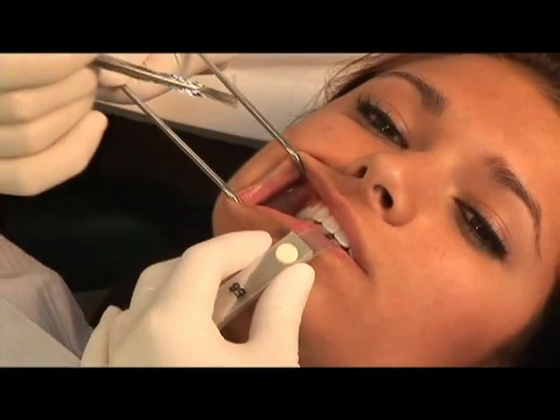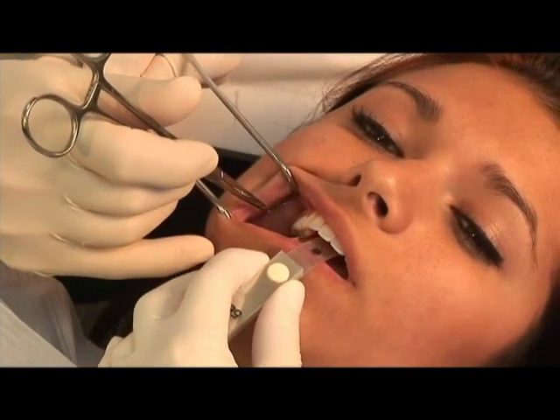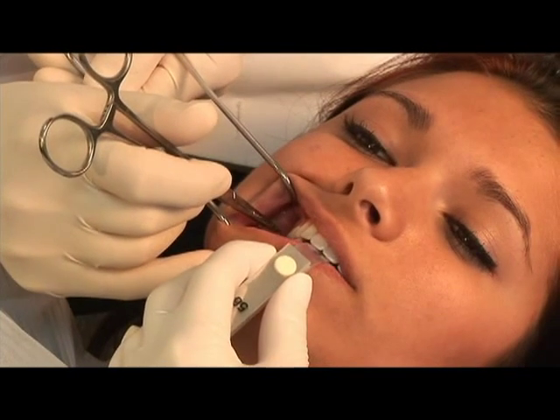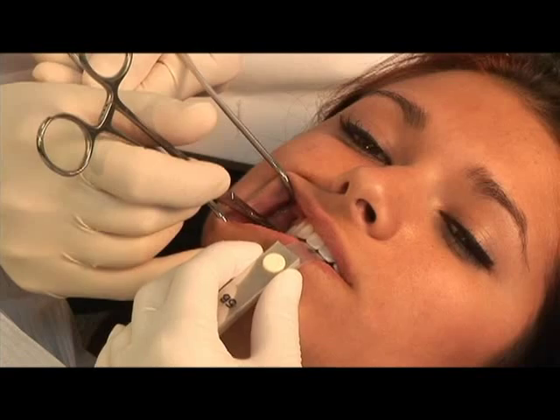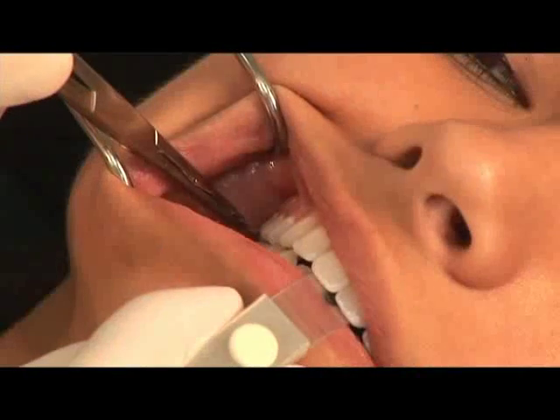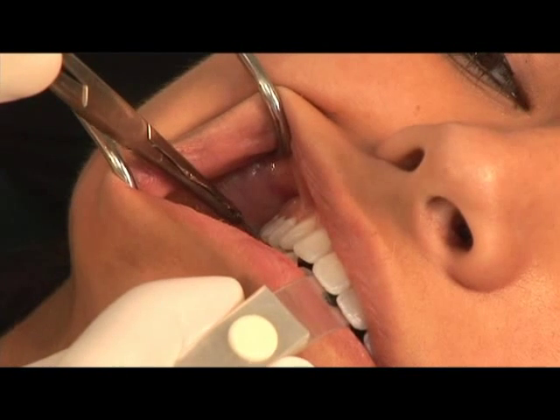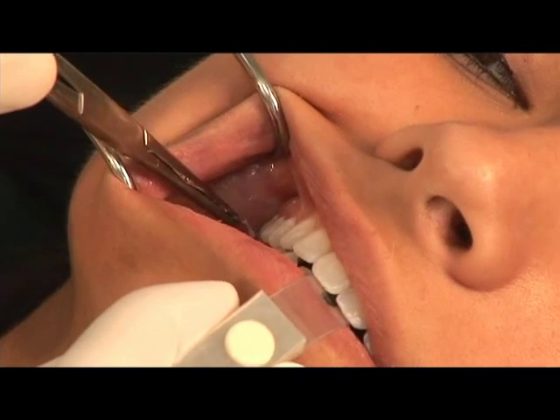Okay, Holly, if you'll take the leaf gauge there. Open for me a little bit here. Pull your tongue back a little bit. Close for me. Slide forward and back. Okay, that's the contact that we were looking for.